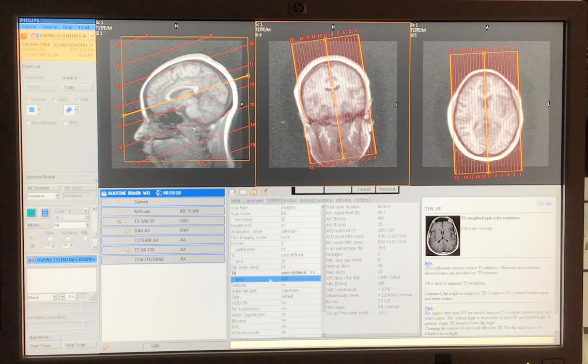So that'll be something that you guys will tell us during the scan, correct? No, that's something that you need to know. Whereas if you pick a TR that is 1,000, is that going to give me a T1 weighted image? Okay, yeah, because they said that you guys would tell us and that we weren't supposed to worry about it until you guys tell us the numbers you want us to use. No, I really want you guys to. That's what Cindy said anyways.